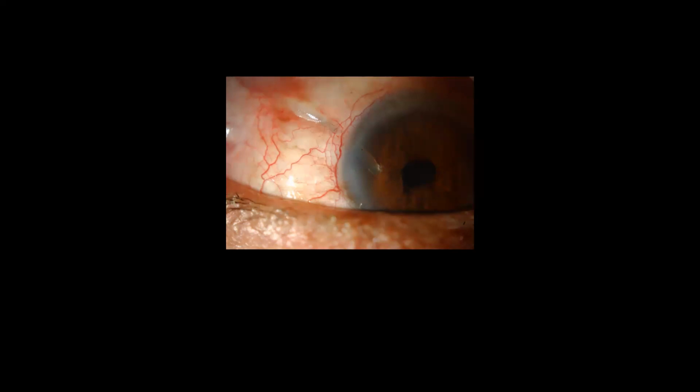Some of you might think that this is not important, but actually it's of extreme importance for us. If this is a recent surgery of 3 months duration, and the patient already developed this thinning and exposure, it will highlight to us that even if you revise it again with the same patch graft, the patient might have recurrent exposure. So you'd like to change the type of graft that you used before, or at least have a double pericardium if it was pericardium before, or preferably change it to a stronger patch graft.